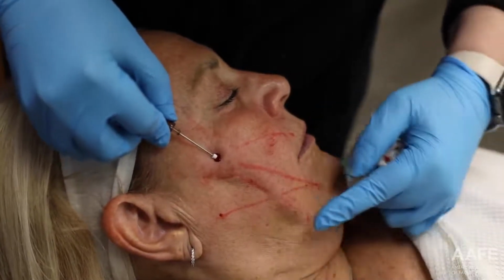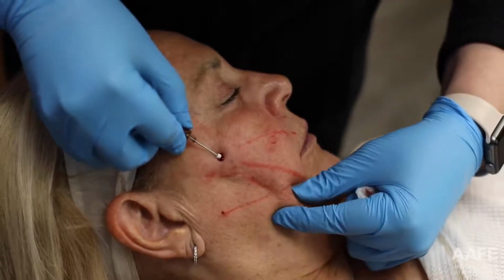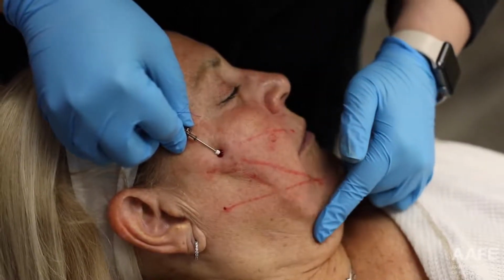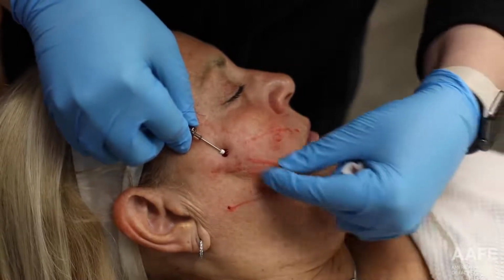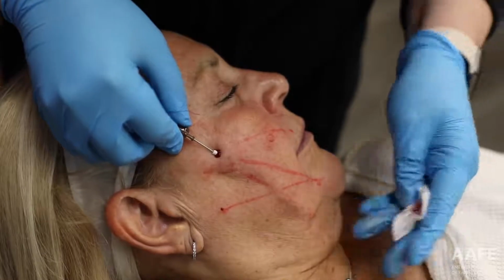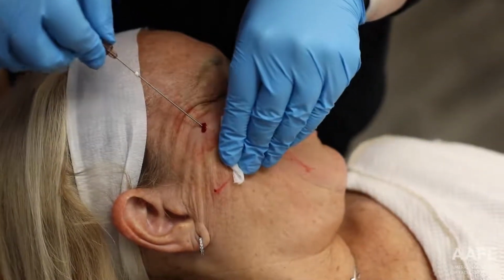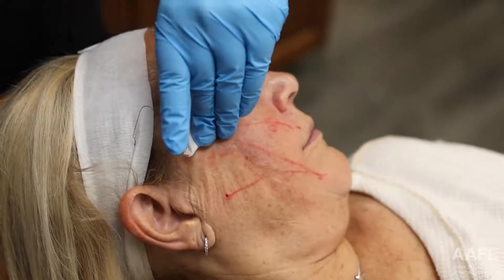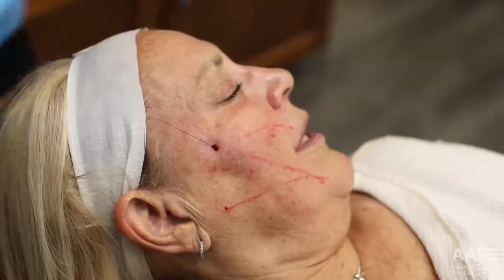You can see I'm just advancing ever so slightly, just little baby bits at a time, and constantly feeling my tip, and you can see the depth of that. Just the tissue's just like a blanket over the cannula. So that looks good, and I'm all the way down into the jowl. So now I'm just gonna put gentle pressure, exaggerate that lift up as I'm pulling out the cannula, and that will engage that thread into the tissue. So the first one's in already.